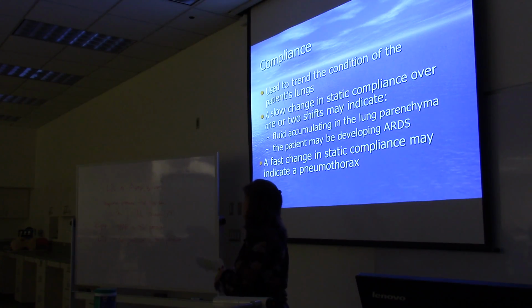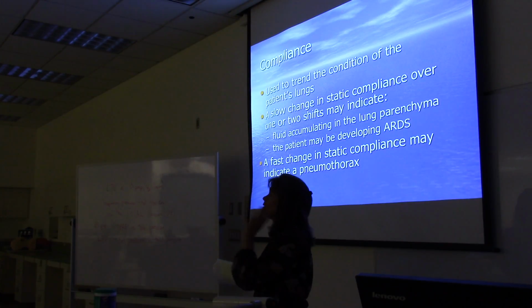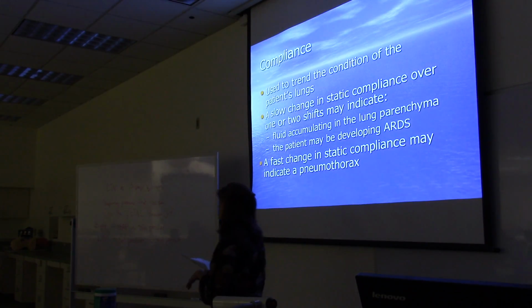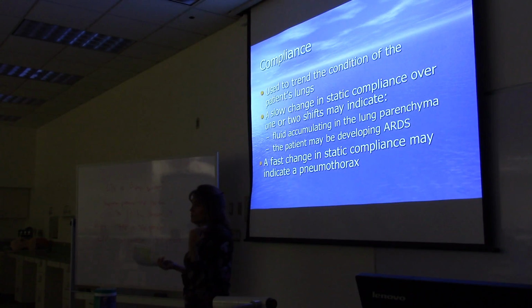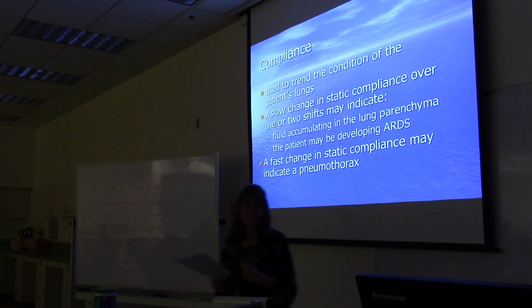So if that starts happening, let's say you start the shift, the patient's doing great and has good urine output, and you get a plateau pressure and you write it down. And then you're there 12 hours. 12 hours later, urine output has really decreased. Still getting their fluids, and now you do a plateau pressure. You're going to notice your plateau pressure is higher than it was 12 hours ago because fluid is accumulating in the lungs.